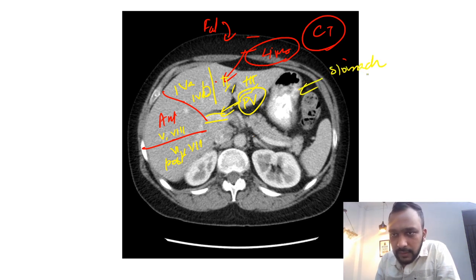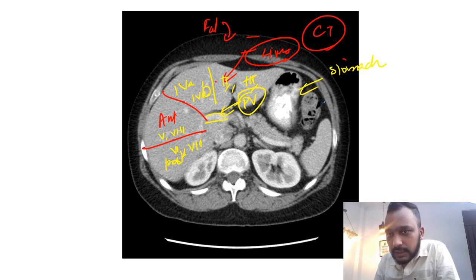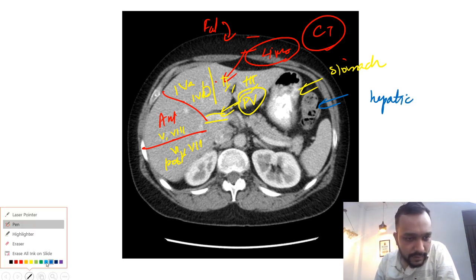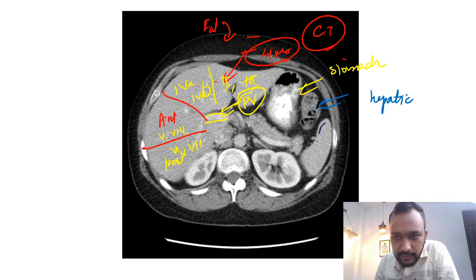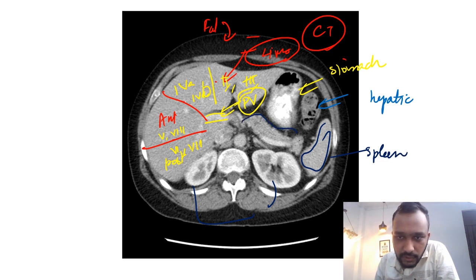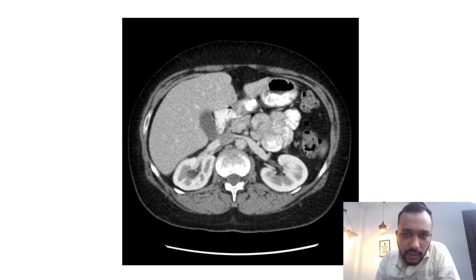This is your stomach, which is filled with oral positive contrast. This is the hepatic flexure of the colon. This structure is your spleen. You are seeing the two kidneys here, and this is your pancreas. This is the normal CT anatomy at the level of the liver.